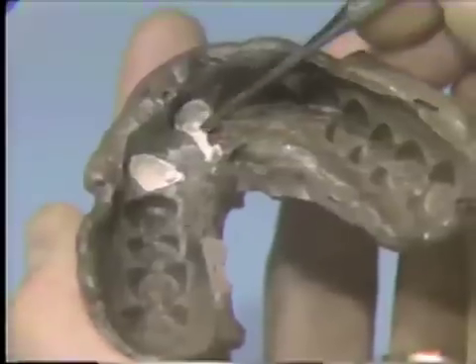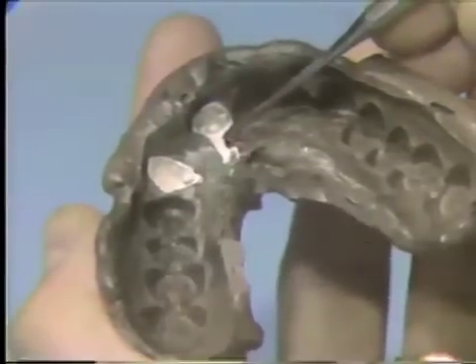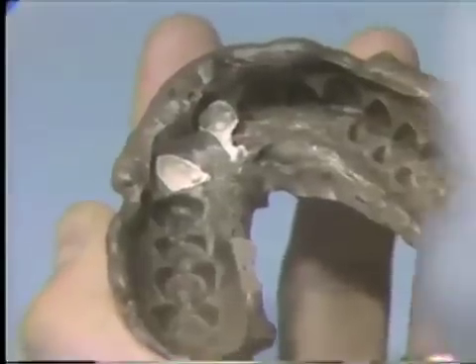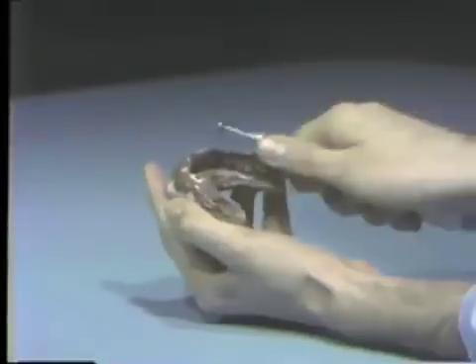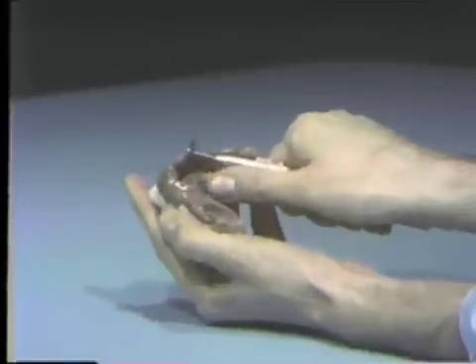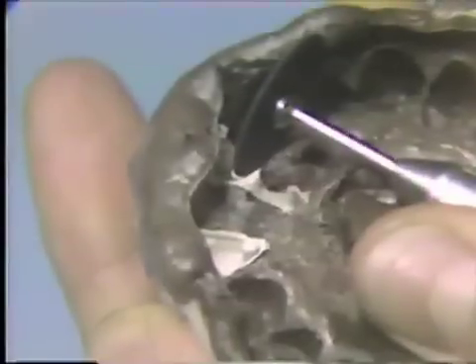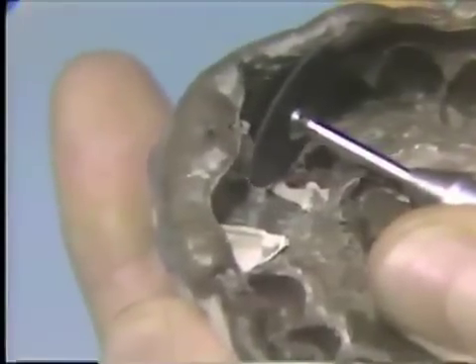The remaining lead of silver can be sectioned at this time and removed. With a carborundum disc in a straight handpiece, carefully section away the lead, taking care not to damage the die or the underlying rubber base.